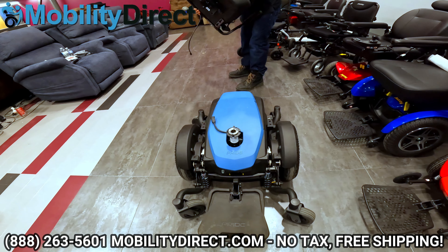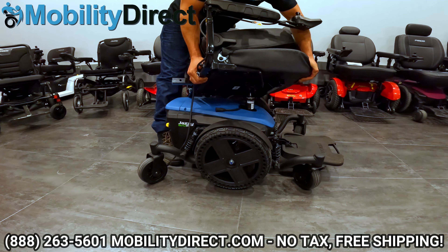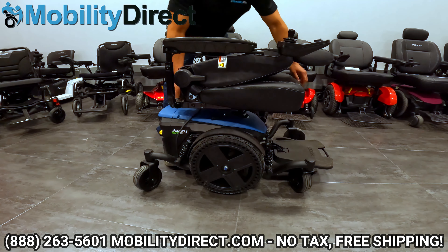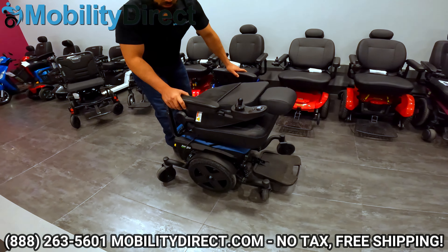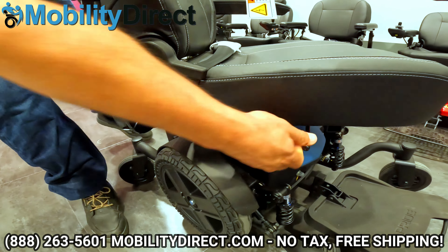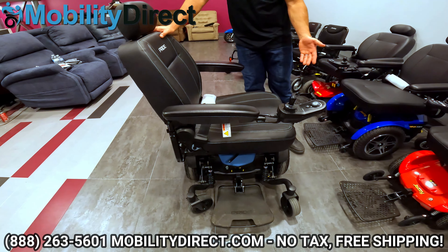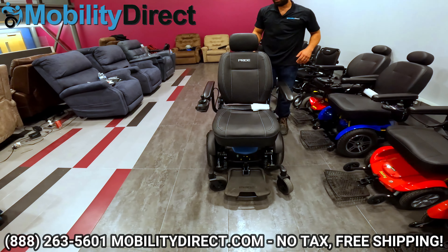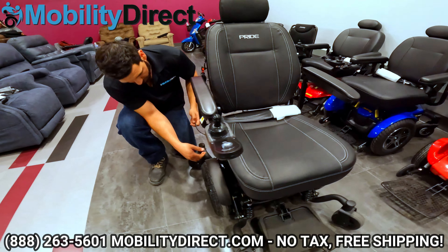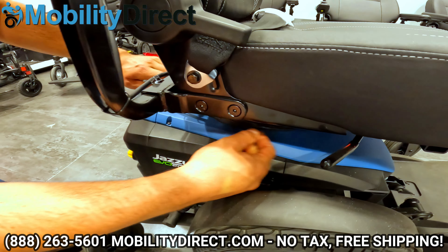To put the seat back on, visualize the connection of the male connection with the female connection and level out the seat — let it fall into place. You'll know it's locked in when the seat doesn't rotate freely. You can rotate the seat intentionally with the rotation lever on the right side, which lets you face the chair sideways to make it easier to get in and out or to pull up to a table. Don't forget: the power chair is not going to turn on until you reconnect the joystick cable. Grab the harness and reconnect.